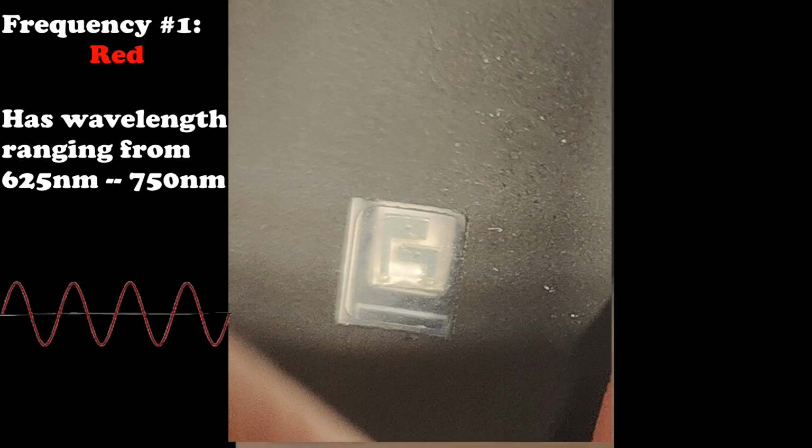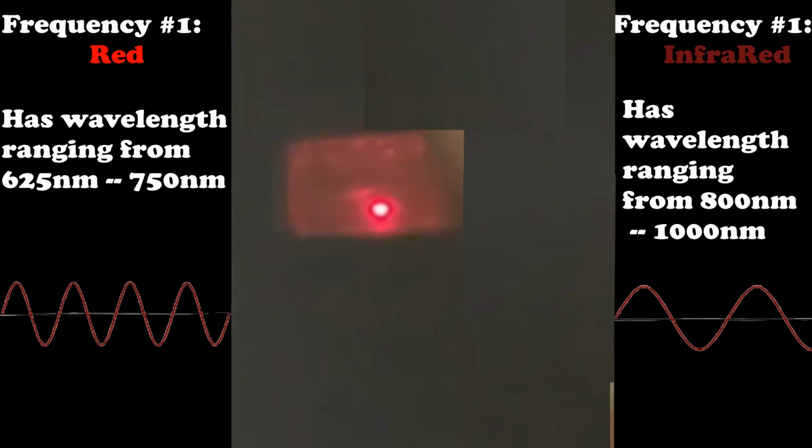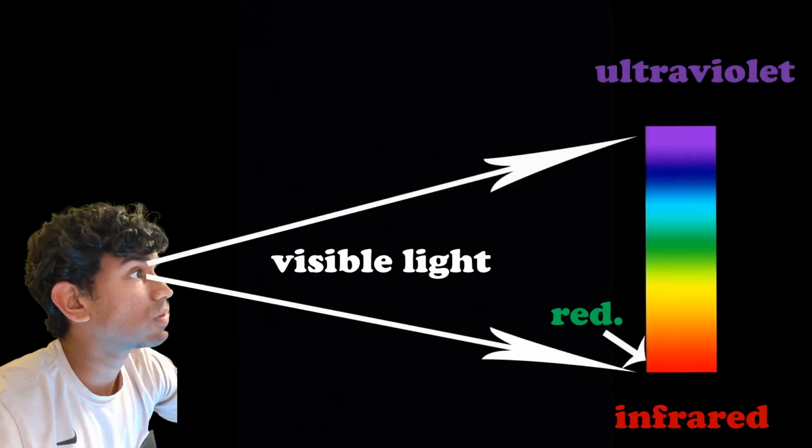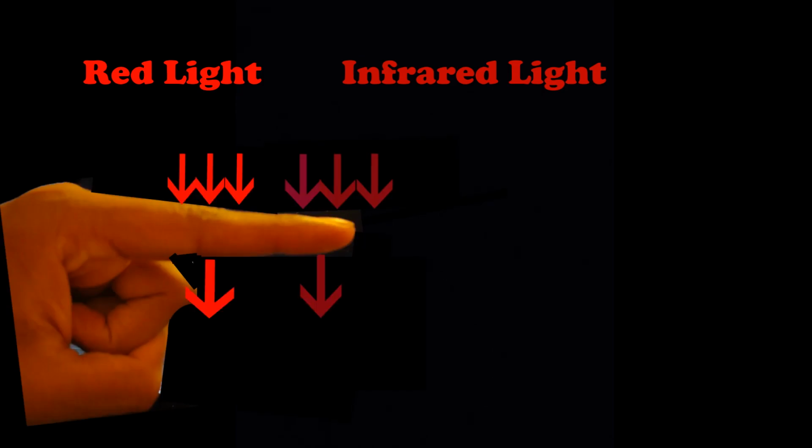Now, let's get into how it works. You are entering the pulse oximeter in 3, 2, 1. First area of business. Look inside here, see this bottom window? In just a few seconds, this window is going to emit light at 2 different wavelengths, red and infrared. Like that. Well, technically, you'll be able to see the red light. You can't see the infrared because our eyes can't see light at that wavelength. But basically, these 2 lights are going to shine into your finger, through it, towards the blood cells rushing inside.